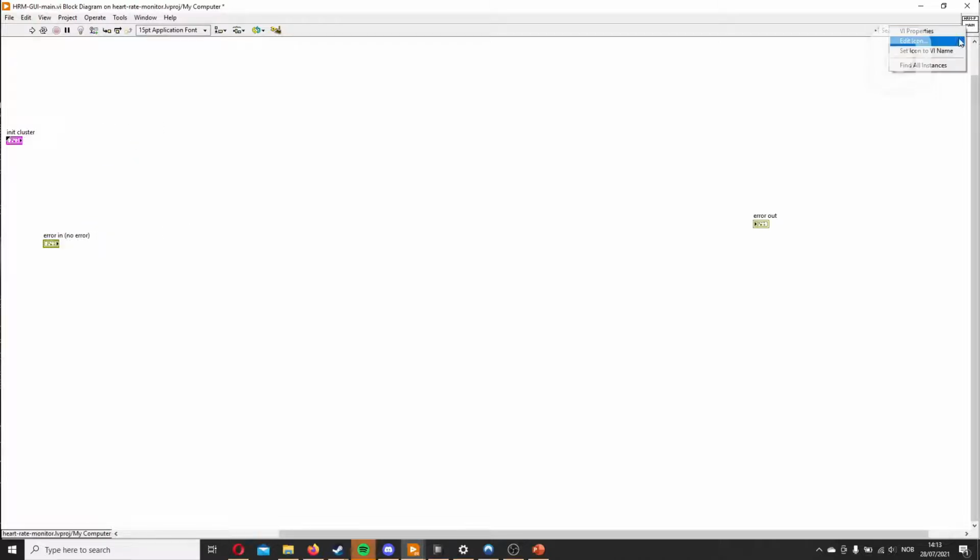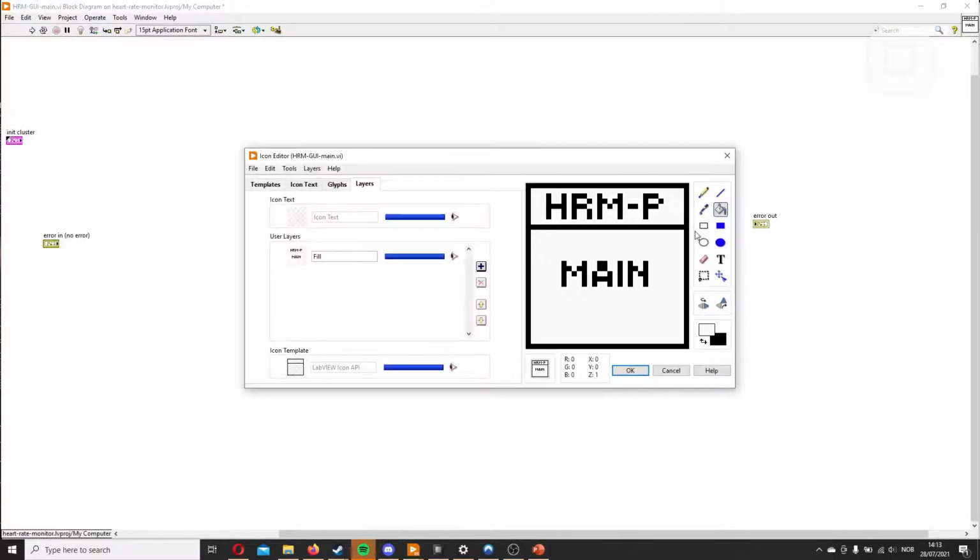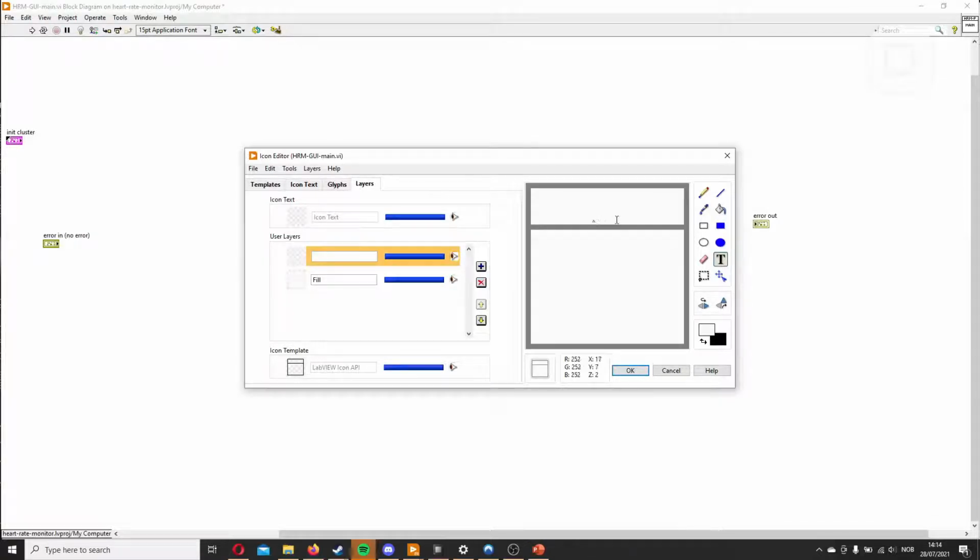We'll start by editing the icon. If we were smart last time, we would have made the background one thing and then the letter something else. But since we weren't that clever, we will have to delete it all. And then we'll take this and this as white, and then we can make a new layer and write in the names, so it would be easier to copy later. Heart rate monitor, G for GUI, and then we can write here GUI main.